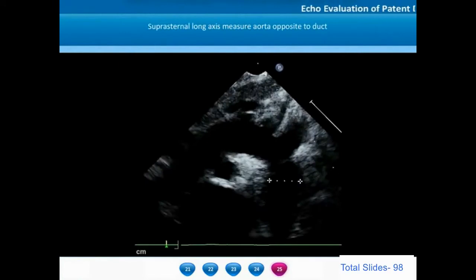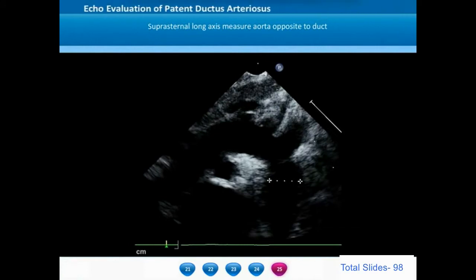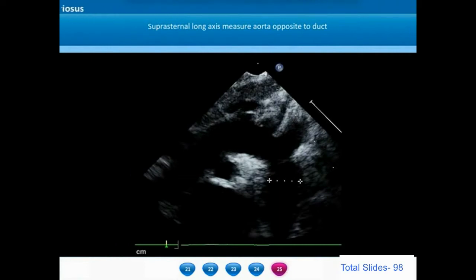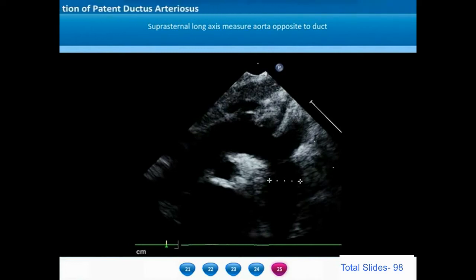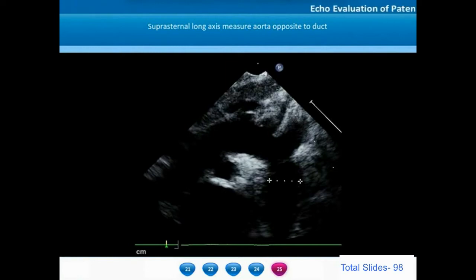We should measure the aortic dimension in the proximal descending thoracic aorta where the ductus is originating. This measurement of the aorta opposite to the duct, taken in the suprasternal long axis, gives a rough idea about how large a device can be placed in the ductus arteriosus. If this dimension is very small, a larger device to occlude the ductus may compromise the aortic lumen.